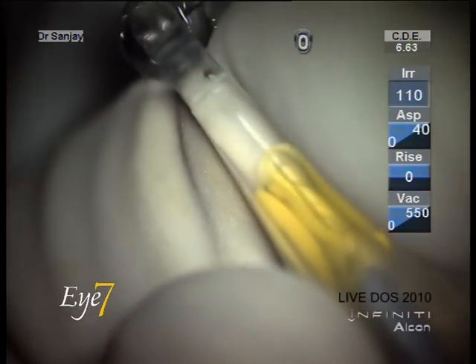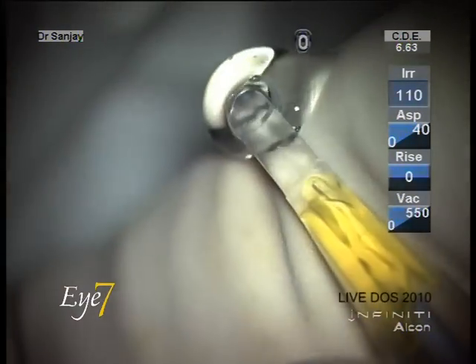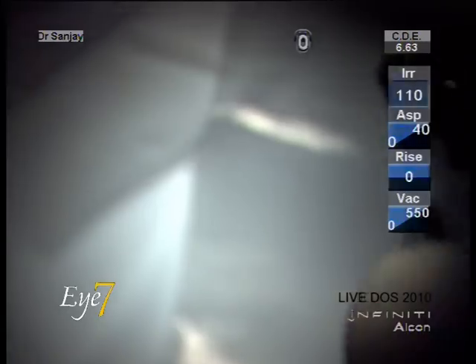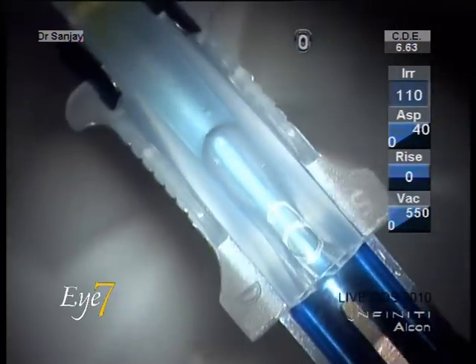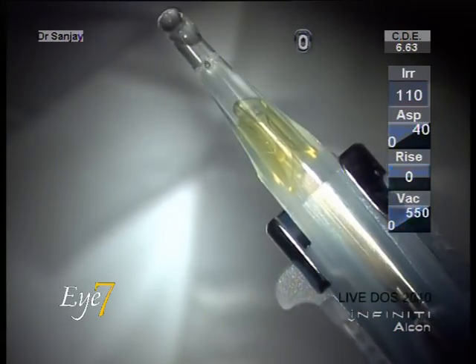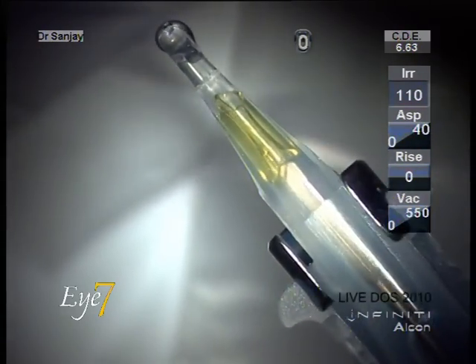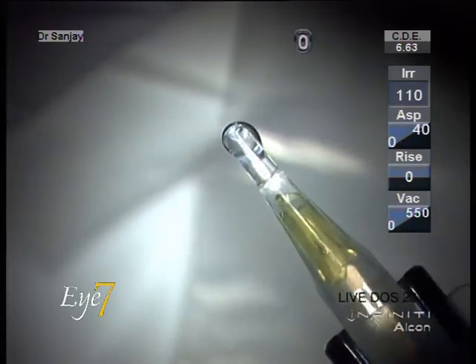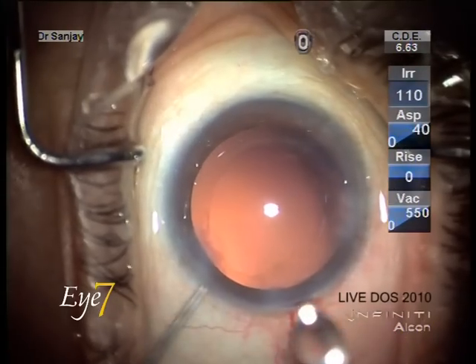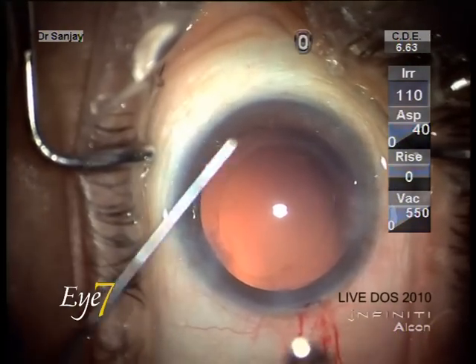The lens is loaded into the cartridge and the pusher moves it towards the tip of the cartridge. The cartridge is then loaded onto the injector and the plunger engages the intraocular lens, stabilizing it towards the tip of the cartridge — the nozzle.